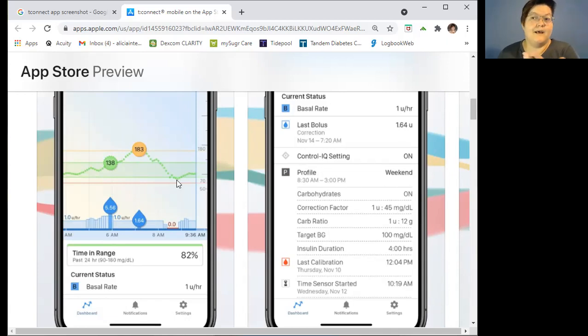You can come in at a 92, and you can sleep there all night because the system doesn't freak out and start reducing your insulin unless it looks like you're going to drop below that. So if we come in nice and slow and easy so that we're not throwing off all these Dexcom trend alert things in the system, we can come in low, we can come in slow.